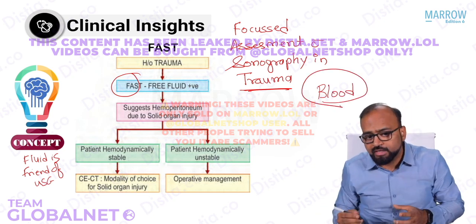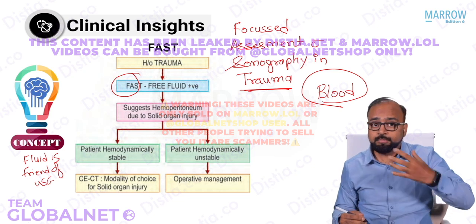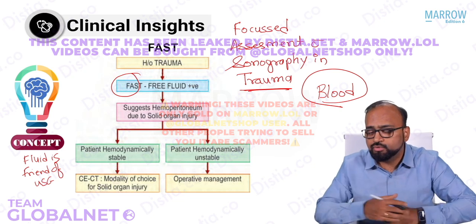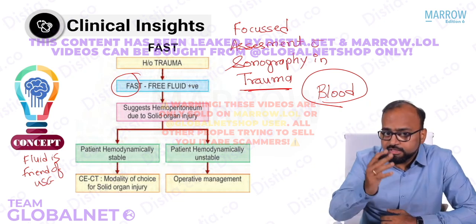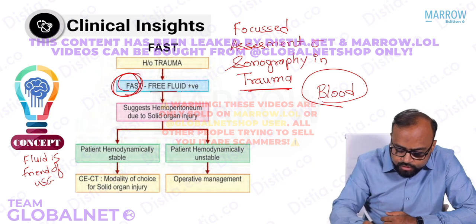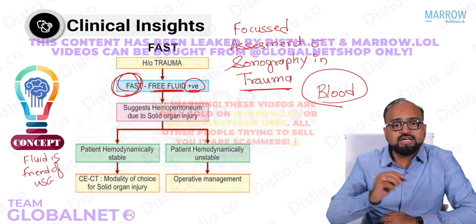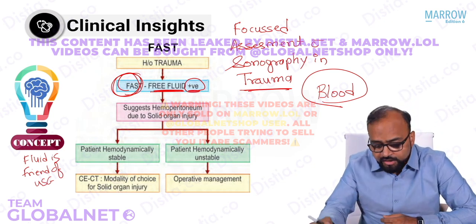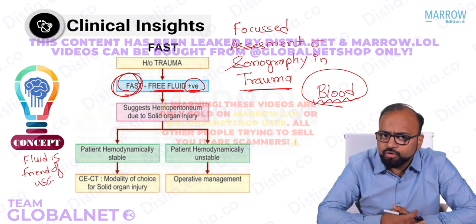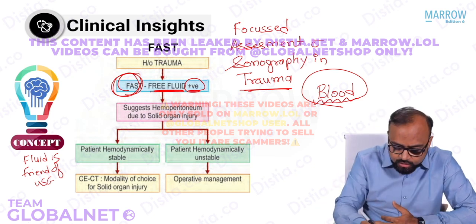From where is that blood coming? This blood is coming probably from a solid organ contusion like a liver contusion or laceration, or a splenic contusion or a laceration. So the first step in the management of an abdominal trauma patient is to do a FAST. If you see free fluid, then it is called FAST positive. So FAST positive, and when we see free fluid, it means that that free fluid is very highly likely to be blood. Then what do you do? Then what we do actually depends upon the patient's hemodynamic state.